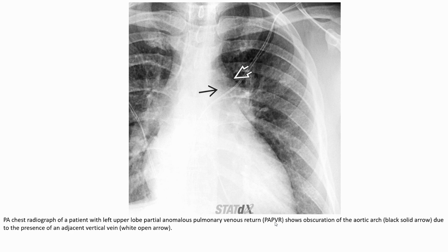In left upper lobe PAPVR draining to right atrium, there is obliteration of the aortic arch due to the presence of an adjacent vertical vein.